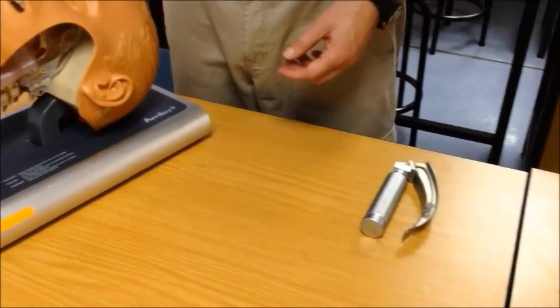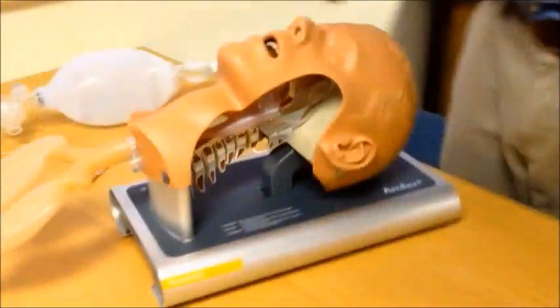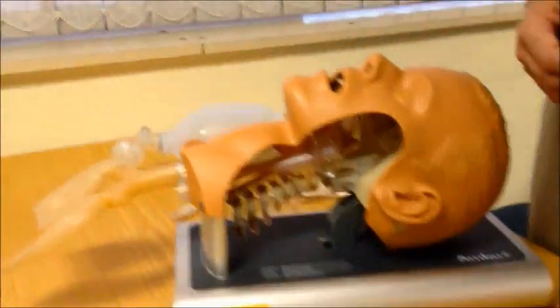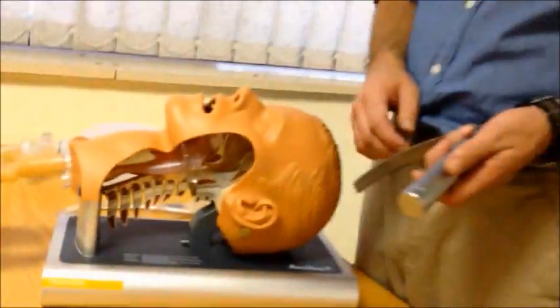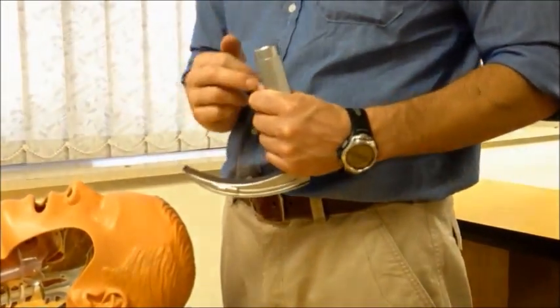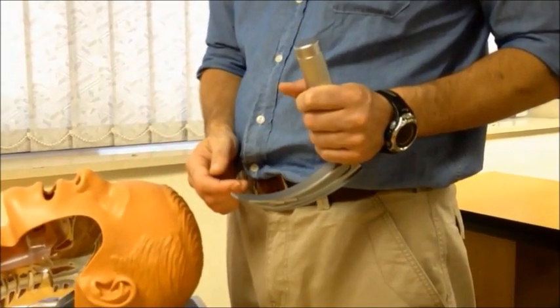Place the ET tube next to the patient on your right hand side or your dominant hand side and use your laryngoscope on the non-dominant hand. Grasp your laryngoscope in the non-dominant hand as shown. Open the blade and make sure that the light is working.